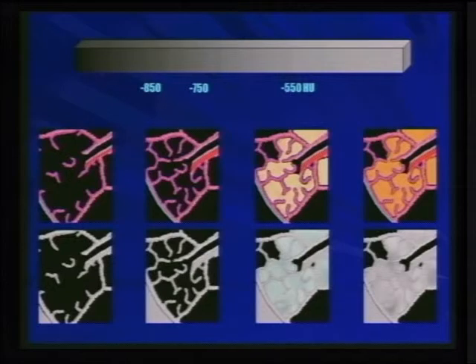So if you look at a single secondary pulmonary lobule and you look at the densities that you see on the CAT scan, if you put a cursor and look at the Hounsfield unit, the normal lung tissue, because it's mainly filled with air with this minimal supporting connective tissue, is around minus 850. And then below that, you're talking about airspace or decreased opacity of the lung.